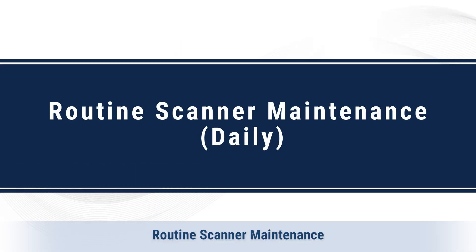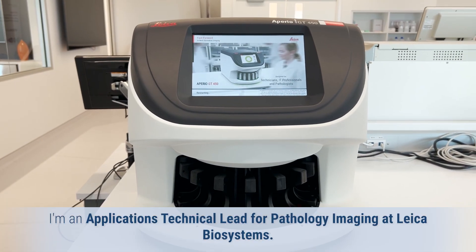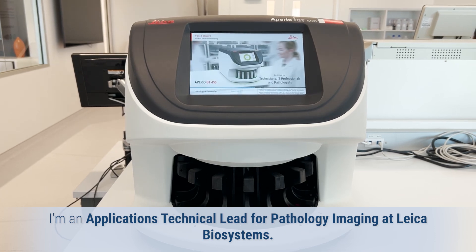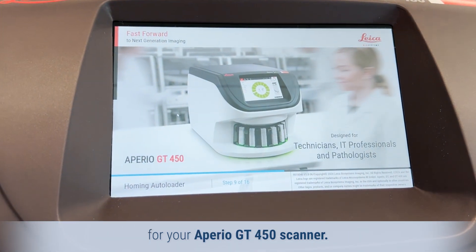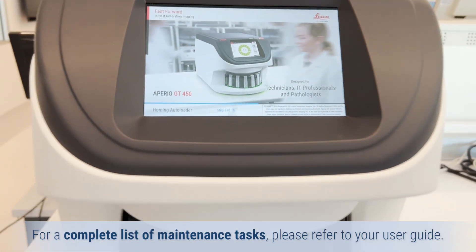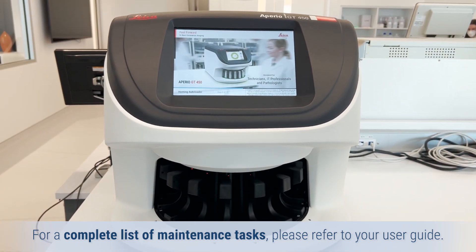Hello and welcome. I am an application technical lead for pathology imaging at Leica Biosystems. Today I'll walk you through the basic daily maintenance for your Aperio GT450 scanner. For a complete list of maintenance tasks, please refer to your user guide.